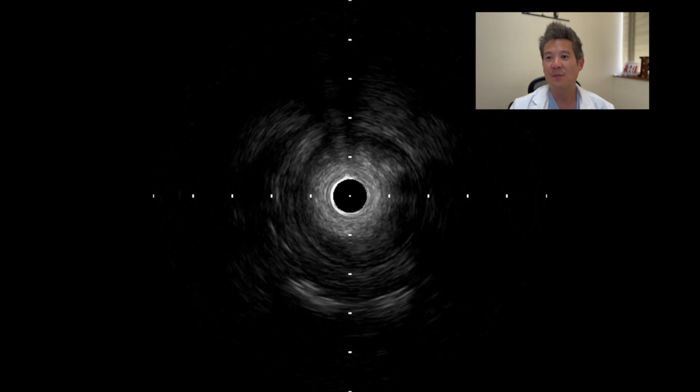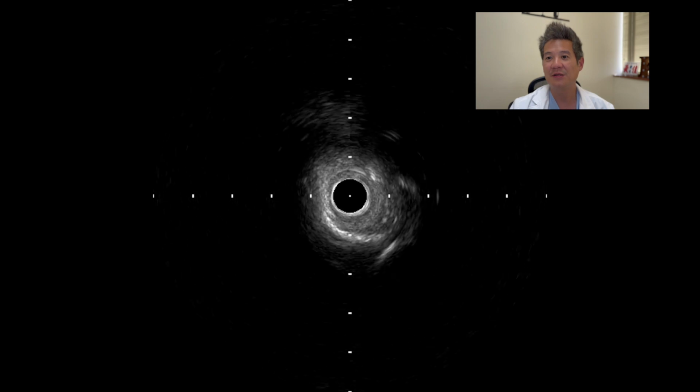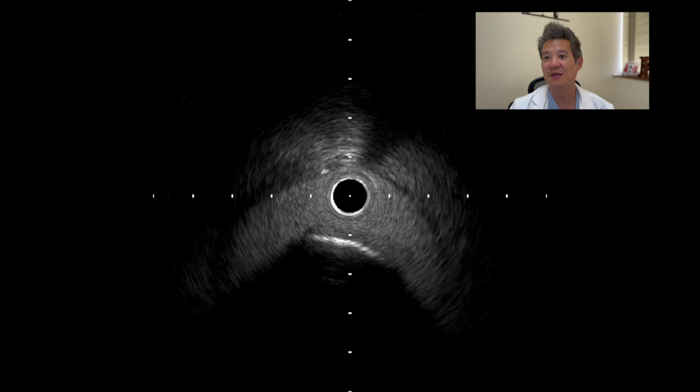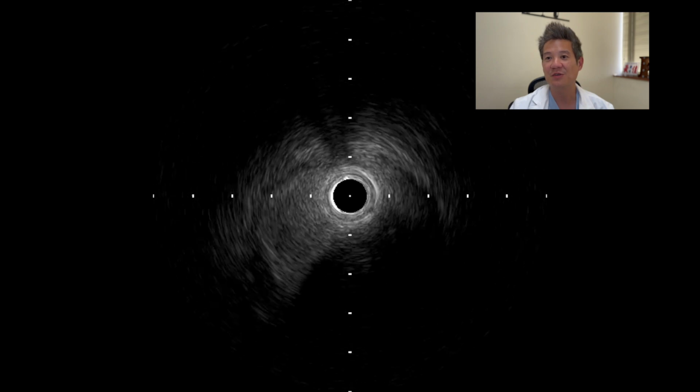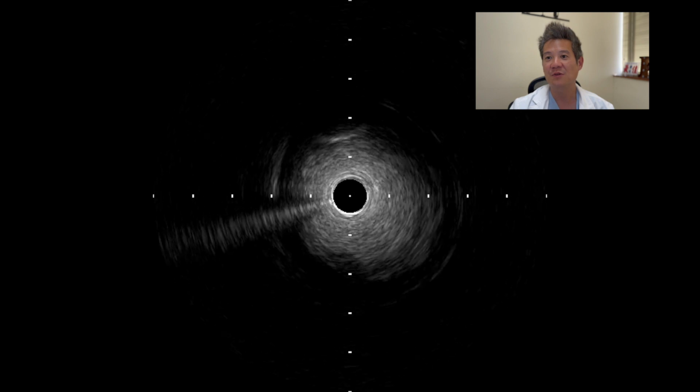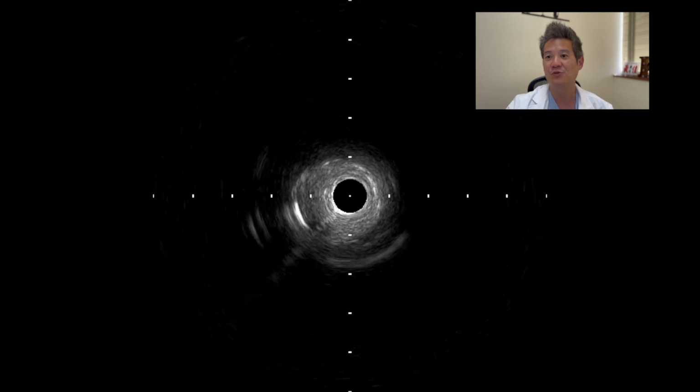And here there's more plaque, and here the IVUS is moving into the subintimal space, and you can see the crescentic subintimal space with the true lumen at 6 o'clock, and very proximally, just beyond the proximal cap, it goes back into the true lumen like so.